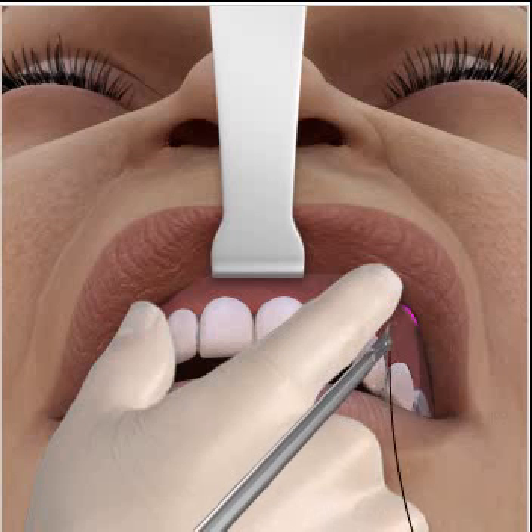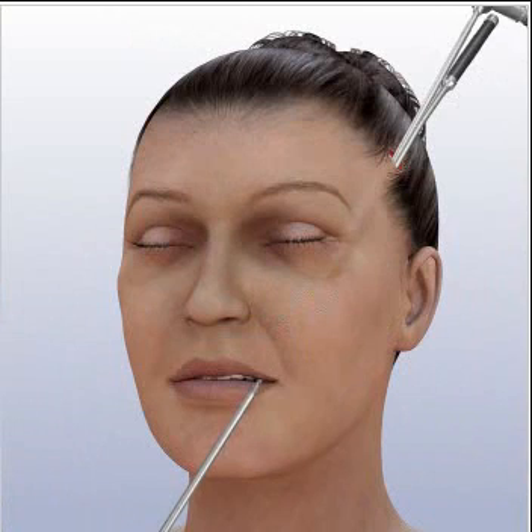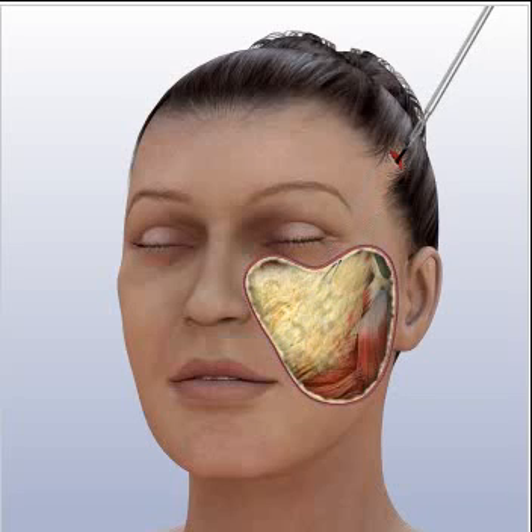The physician will place what are known as suspension sutures in the fat deposits that have migrated downward with time. By threading the sutures through the incision in the hairline, the physician elevates the fat deposits and suspends them in a higher position. In doing so, the physician restores soft, round contours to the midface.